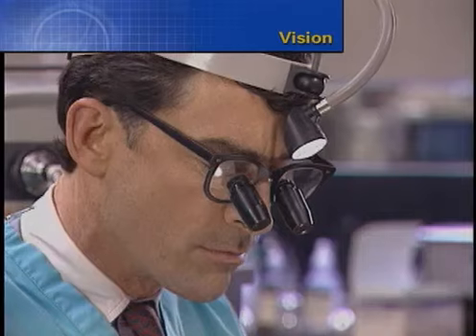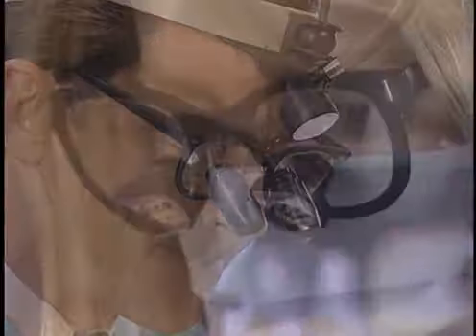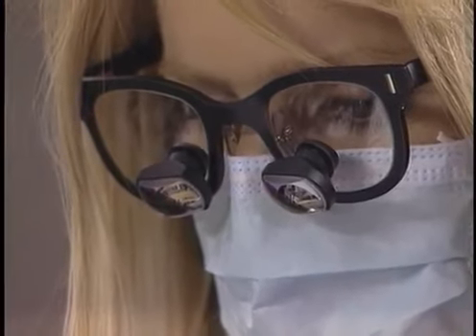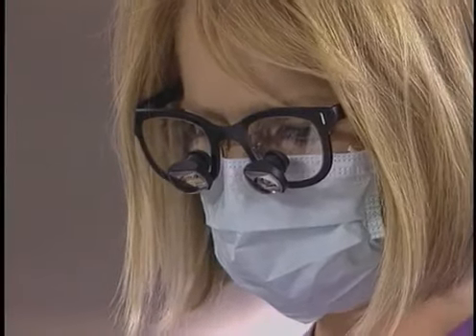Magnification glasses and operating headlamps are most useful when performing endodontic retreatment. Different magnifications afford different powers and provide the clinician with clarity when doing procedures deep within the root canal system.